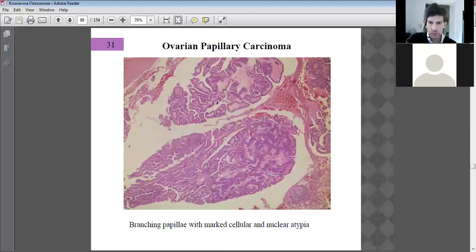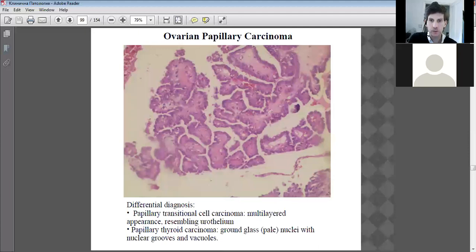The nuclei, we would probably have to get a higher magnification to see. We can't really see the nuclei on this section. Yes, the nuclei are atypical. Round nucleus, elongated nucleus. Fairly normal there. So here, disrupted, elongated nucleus, elongated nucleus. There's more examples of elongated nuclei than round nuclei. Definitely a sign of a type of tumor, or in this case, carcinoma.